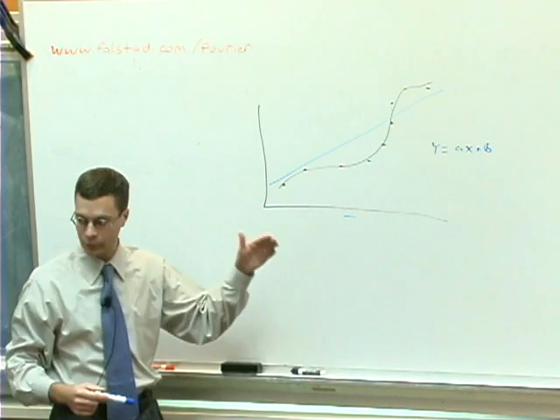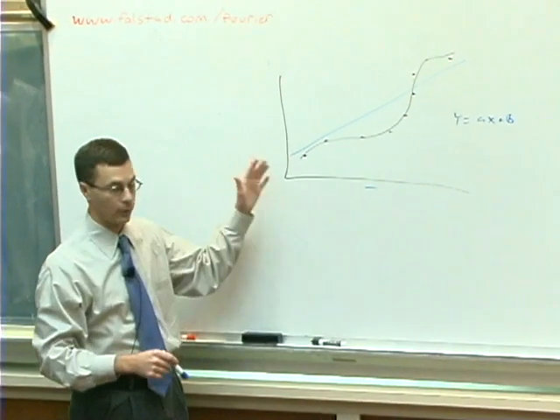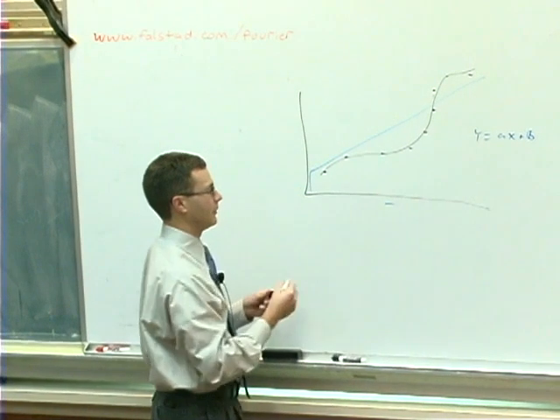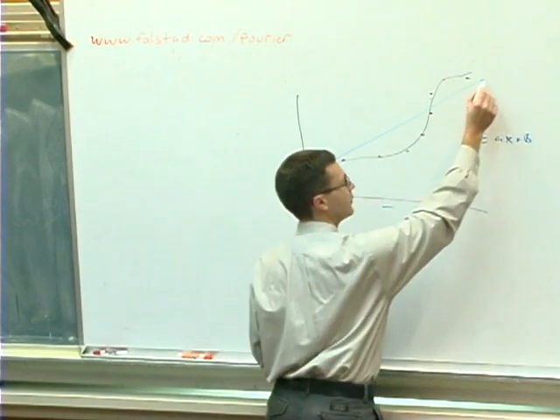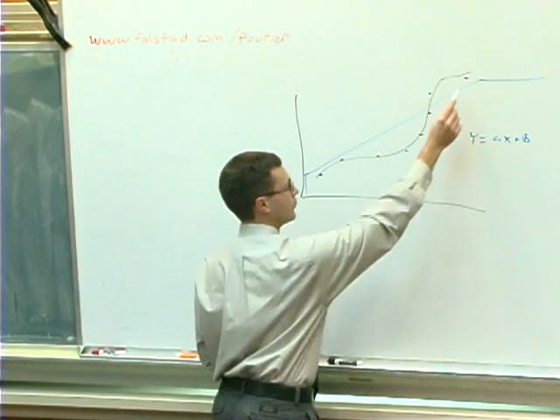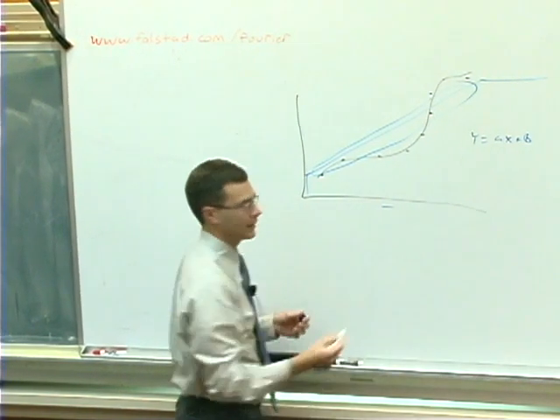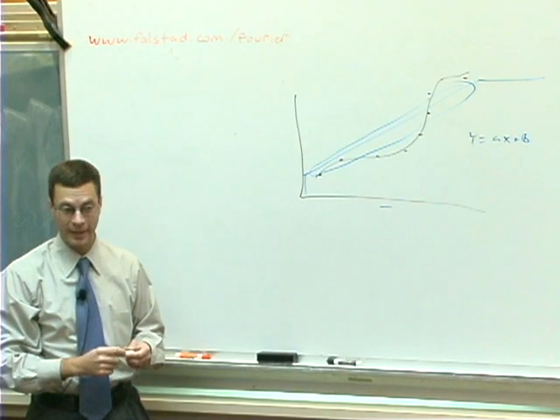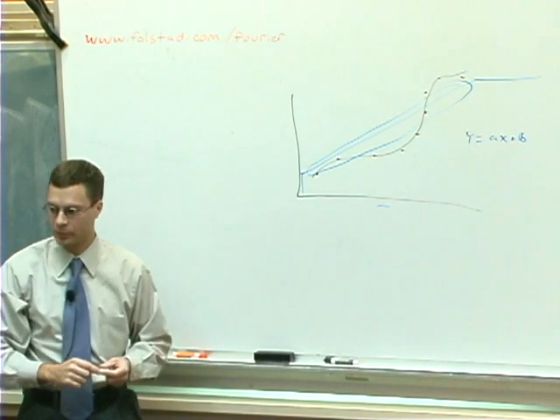So it's pretty close to this. Now, of course, there are nonlinearities, as we talked about, so points at which this curve starts to not be linear. In fact, maybe down here at the bottom, it kind of drops off instead of continuing along smoothly, and that's one nonlinearity. Or it might saturate up here and not continue to rise. But at least for the vast range of physiologic evocations of neuronal activity that we study, the system is pretty close to linear, at least good enough that we can use it. We can make useful models with the assumption that it's a linear system.